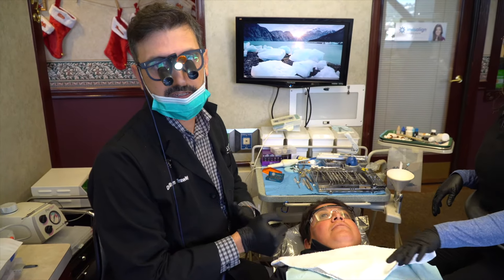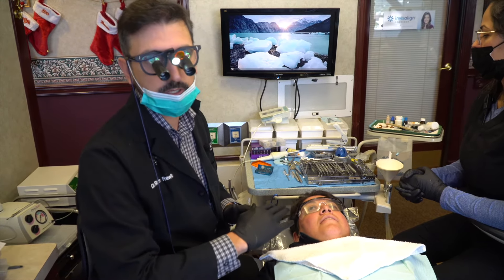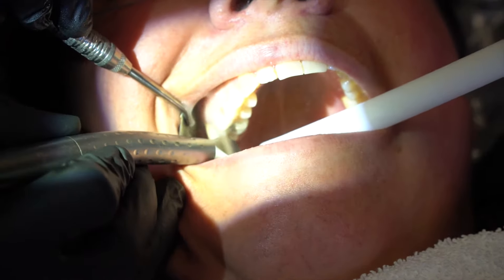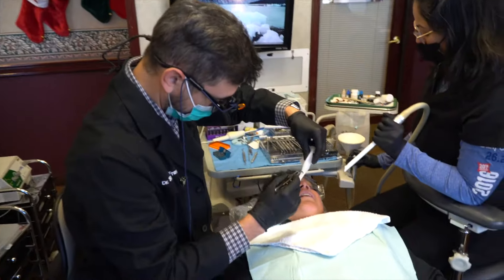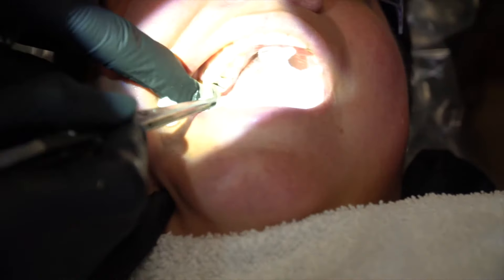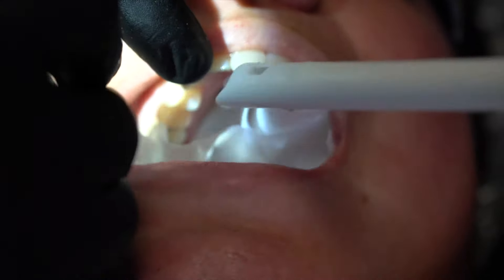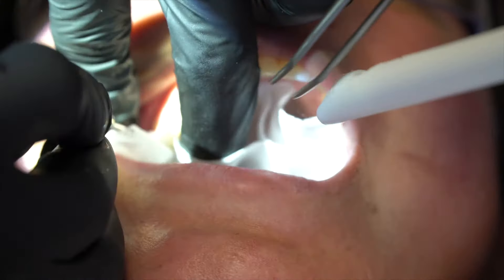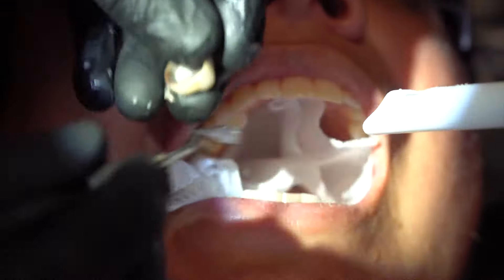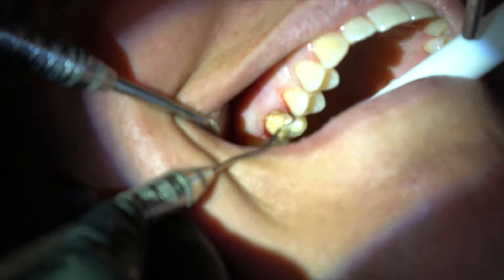We're going to get started. First we're going to take the crown off. It's a porcelain-fused-to-metal crown, and we do that in a controlled fashion by putting a little slit in the crown, spreading it, and very carefully taking it off. Then from there we'll see what's going on underneath. We cut the little slit and put a guard back here just to make sure nothing goes back. Sometimes when we put a little force on it some of the porcelain comes off.